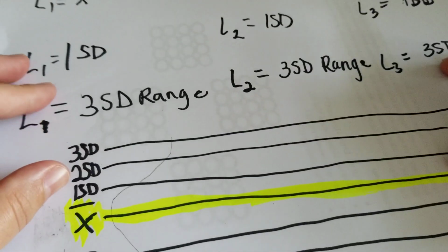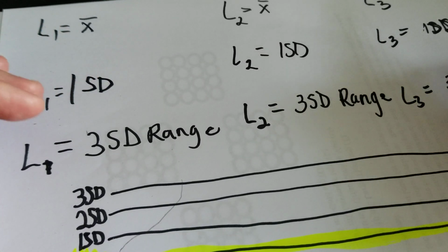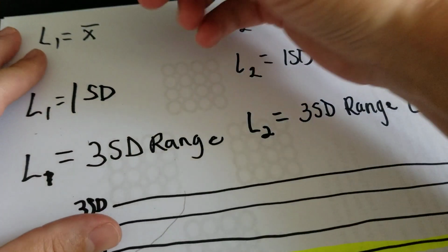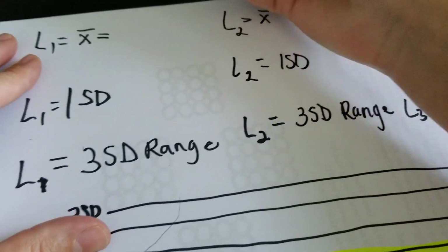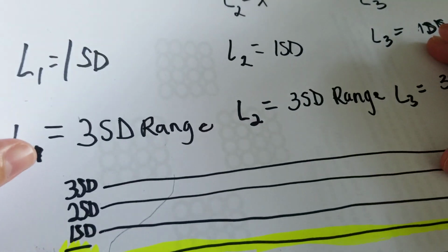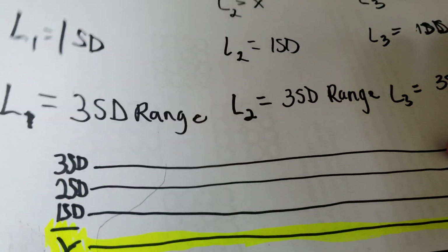Okay, so let's talk about, before we do any plotting or going on about how to put QC back in control, let's talk about how do we calculate it. Okay, so we know that the mean is the average, all right? And so when we give you a question in the lab, or you're given a QC level, you're going to have a range.